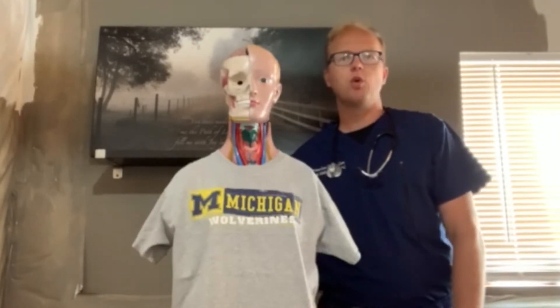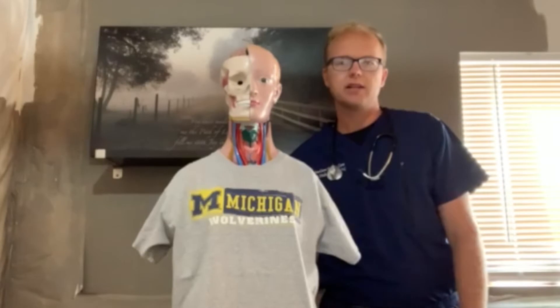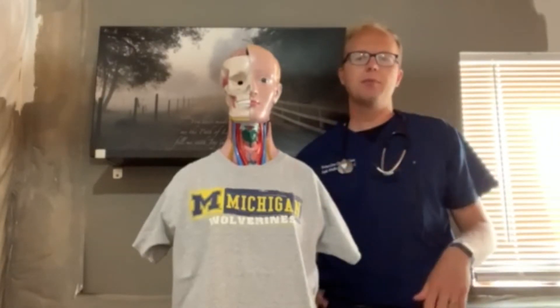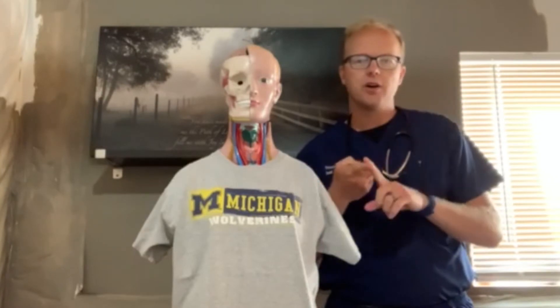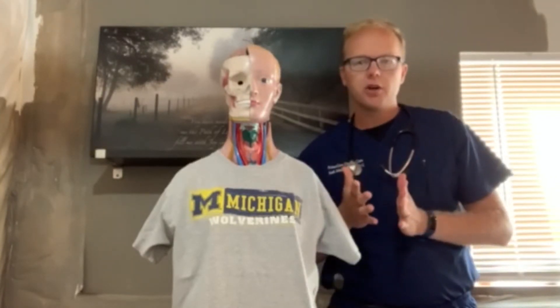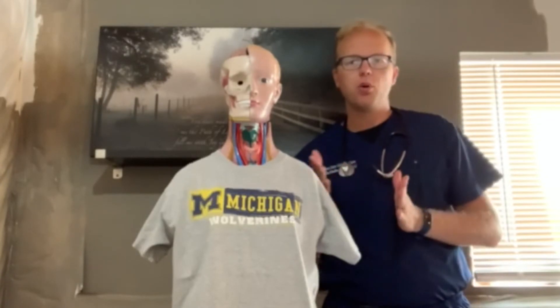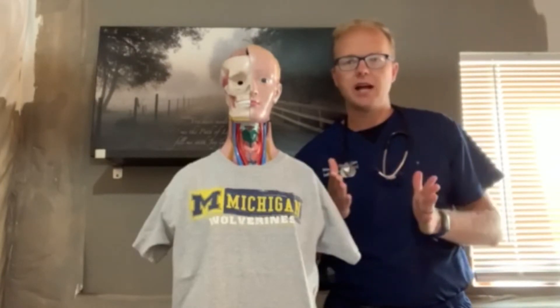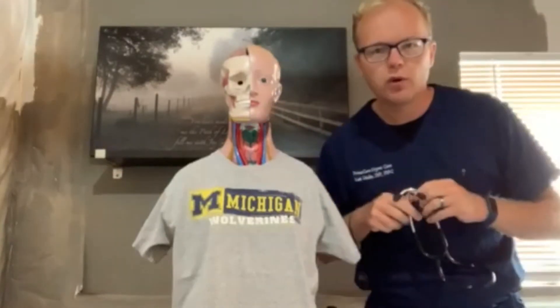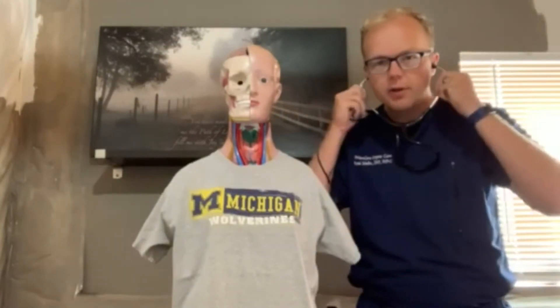So it's time to get some of those first-time jitters out. What I would like you guys to do is practice your auscultation with your stethoscope. You'll have an opportunity to auscultate the heart and the lungs. When you're auscultating the heart, you want to make sure you auscultate all points with the bell and the diaphragm. I'm going to do a brief demonstration of what this might look like on your patient.